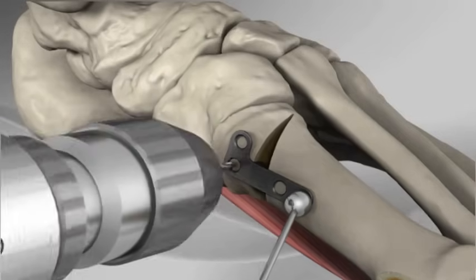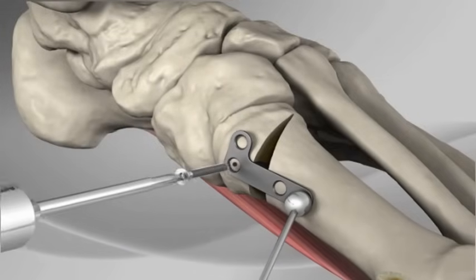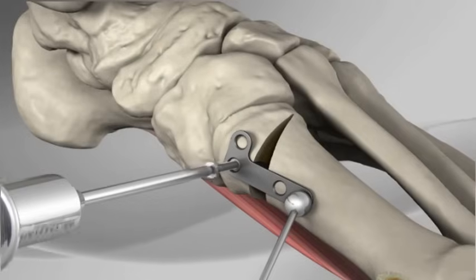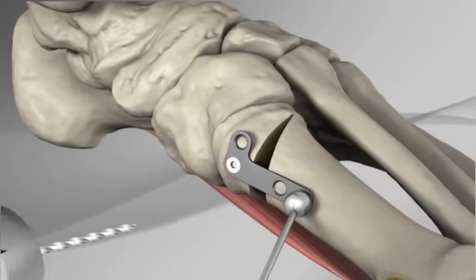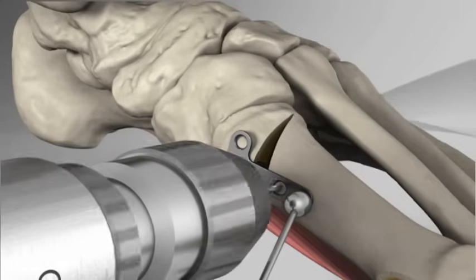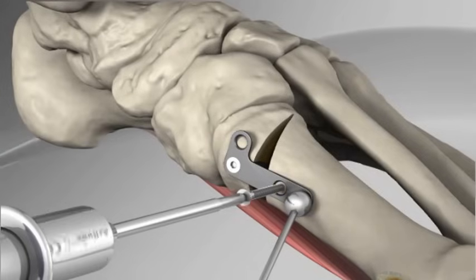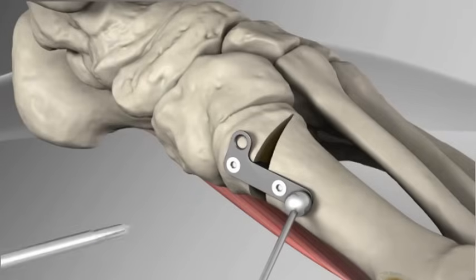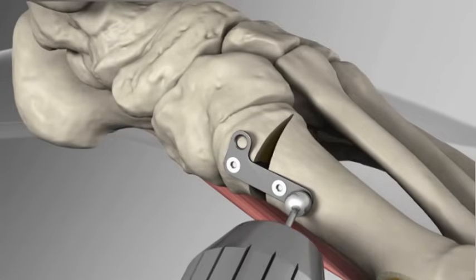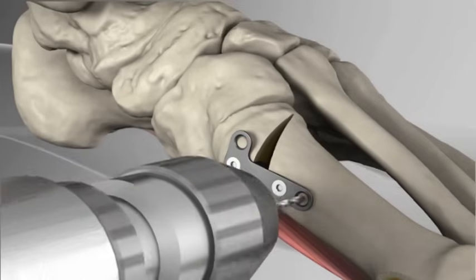A drill and screwdriver are used to screw the plate to the bone. After both screws are tightened down, the wire is removed and a third screw placed.